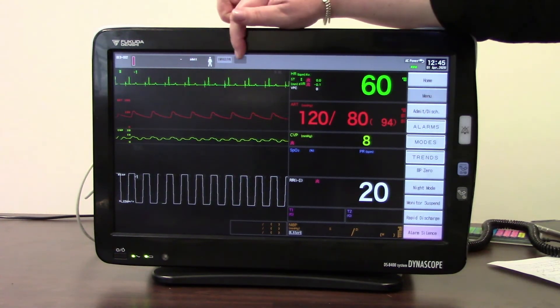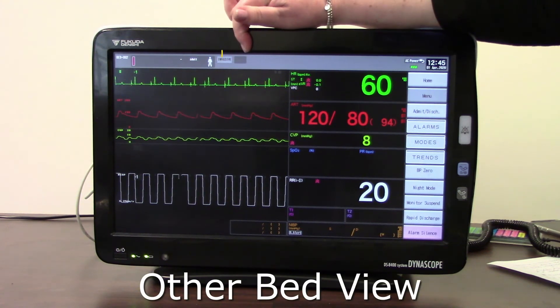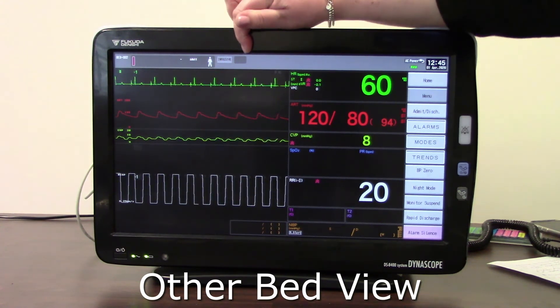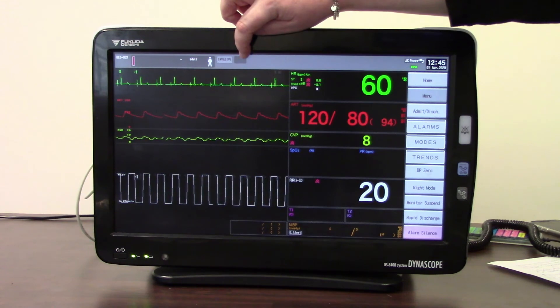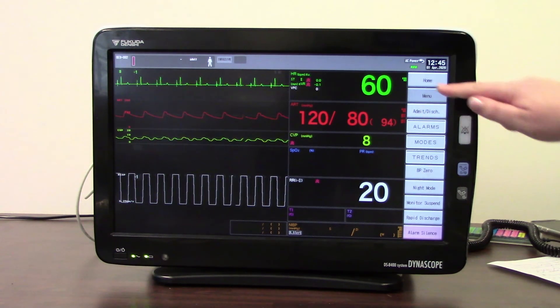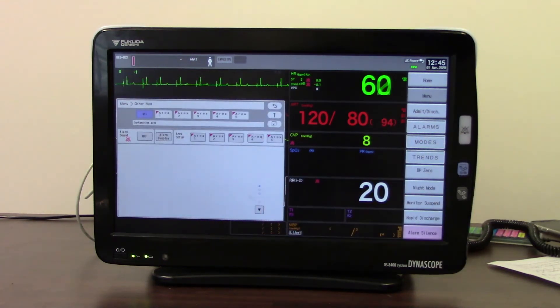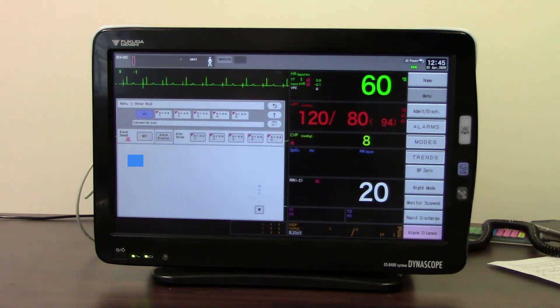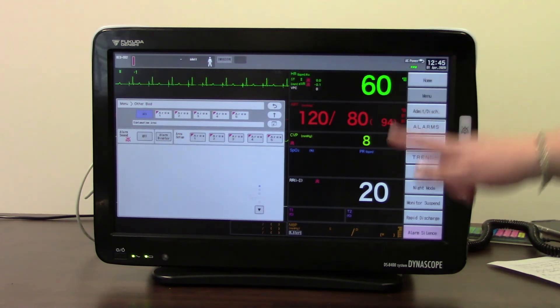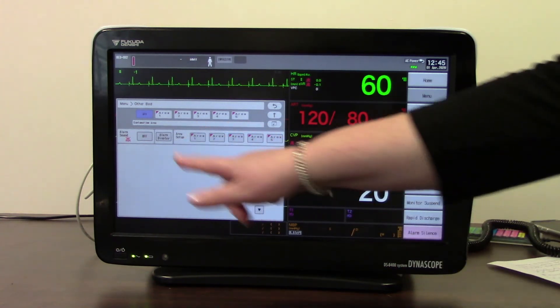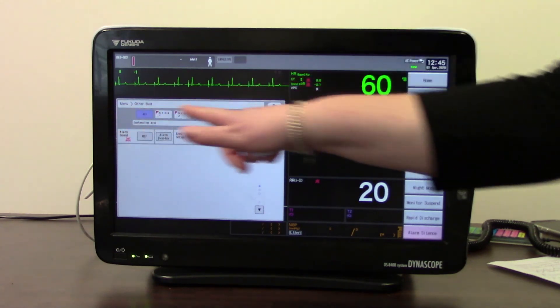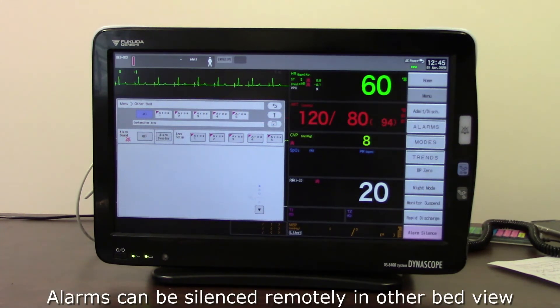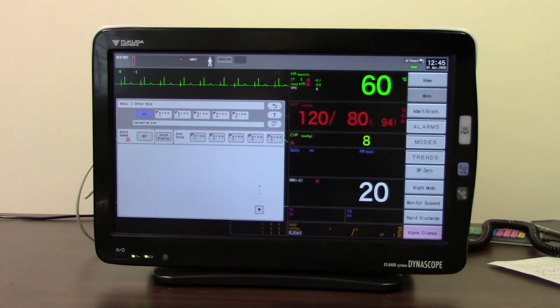The other button is the other bed function. This monitor is not networked so you can't see it at the moment, but you can activate it by touching the button at the top if it says 'other bed', or by going into the menu and selecting other beds. This will show you all of your beds in your department. You can select any bed to view a full picture of that monitor alongside the bed space you're currently in. You'll also have an alarm silence button so you can silence alarms from the bed space you are standing in.